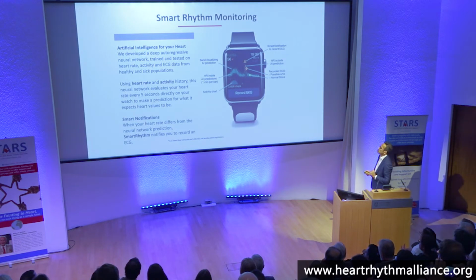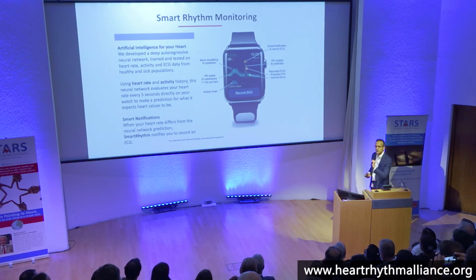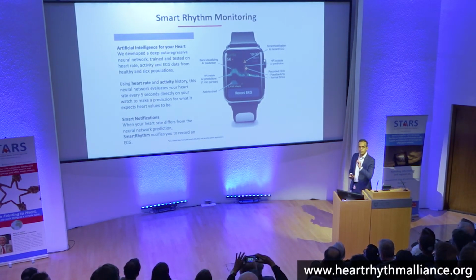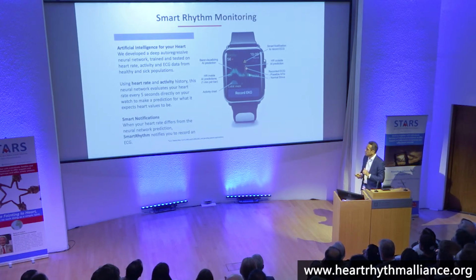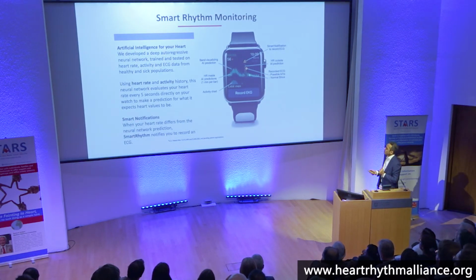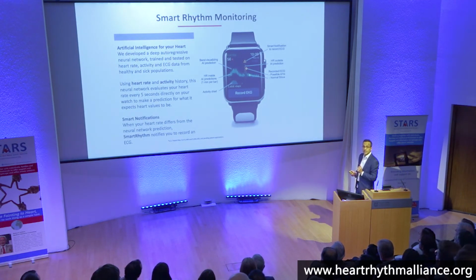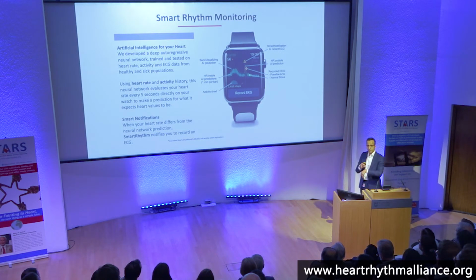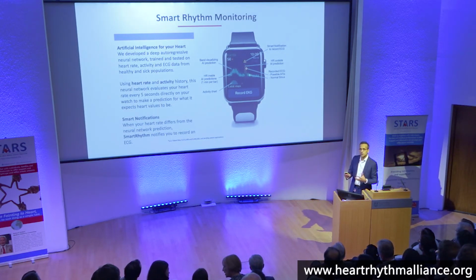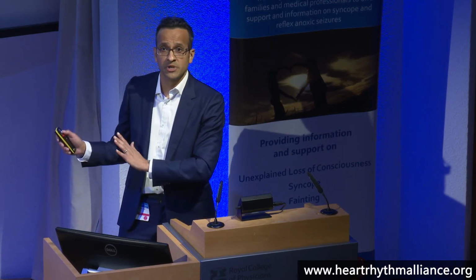So I was asked to talk to you a little about the smartwatch. Recently, correct me if I'm wrong, the president of the AHA came out onto the stage in an Apple event where they unveiled this, and this is the only device which is commercially available and approved by the AHA. Okay, I smell a kickback, but anyway. So this combines photoplethysmography with ECG monitoring. Okay, and Apple have developed an algorithm which uses both the photoplethysmograph and your activity level to determine whether or not you should record an ECG.